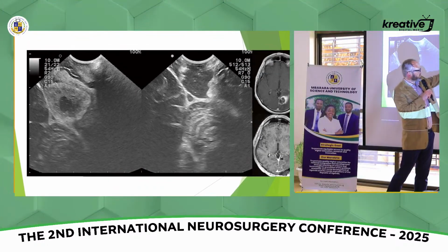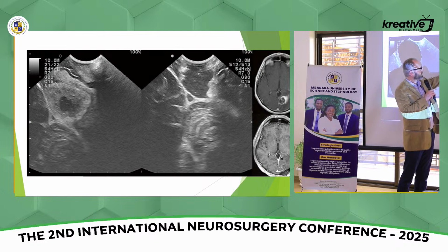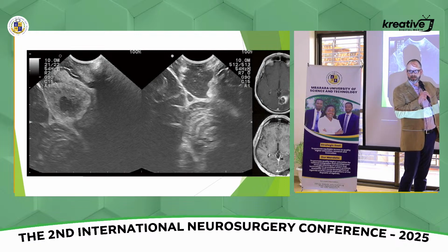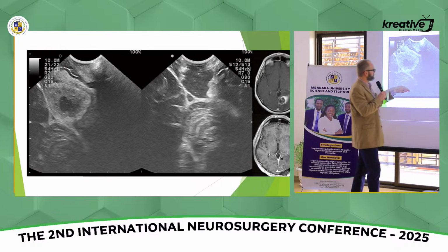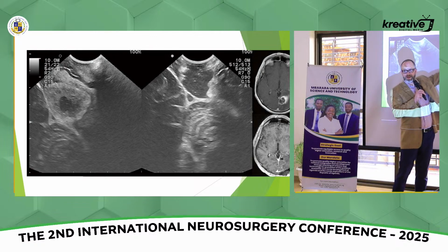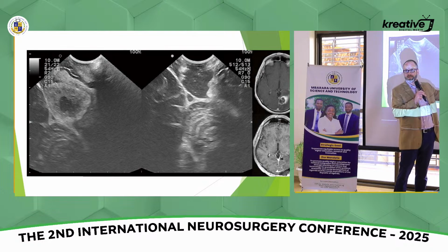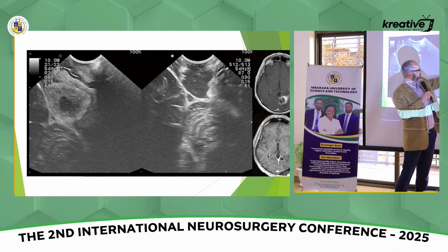After resection, you can see this is right at the tentorium, right? And this is the interhemispheric fissure. And here you can see the folia very nicely of the cerebellum, which was attenuated before, but now we can see the cerebellum really well. Don't let that fool you. We didn't leave tumor behind. We just have, through that fluid cavity, a very bright meninges and tissue beyond.